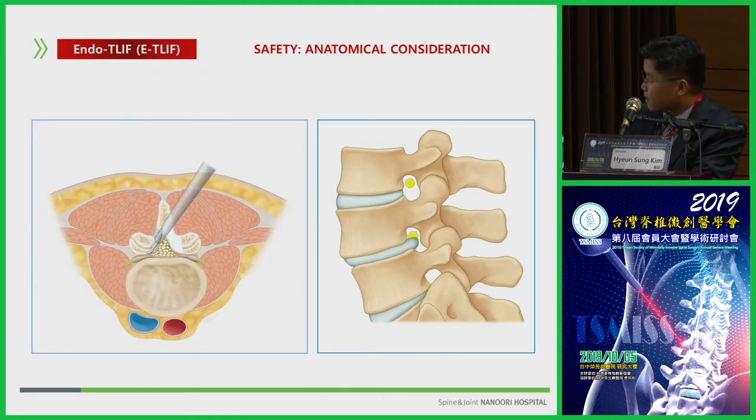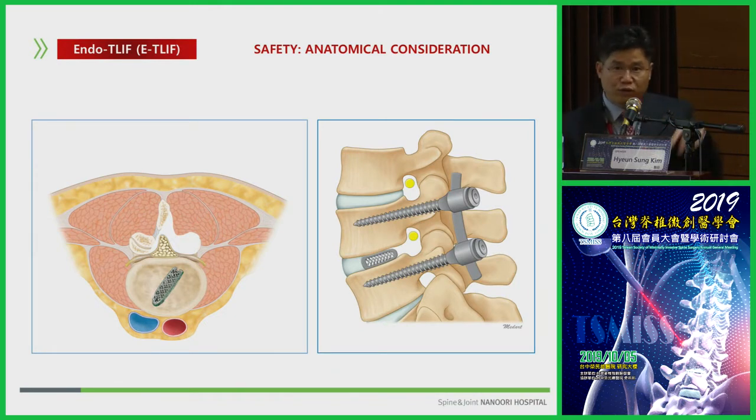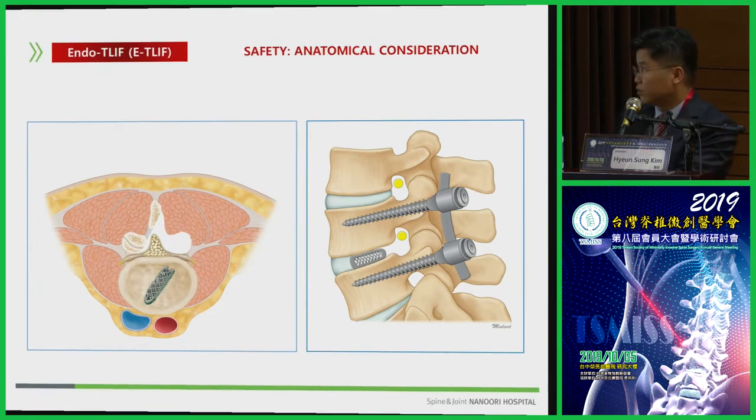It's the surgical technique of my operation: protection and insertion, and changing the angle, and then finally inserting the screw. If we do it with this process, we can perform all kinds of degenerative fusion surgery. Because of that, sufficient decompression is possible, and some restoration is also possible, in spite of the endoscopic procedure.